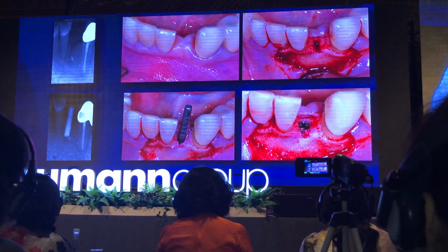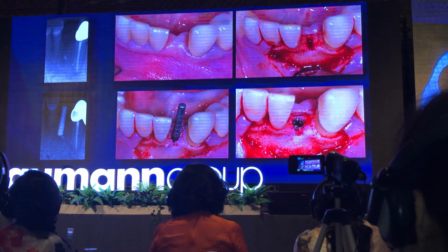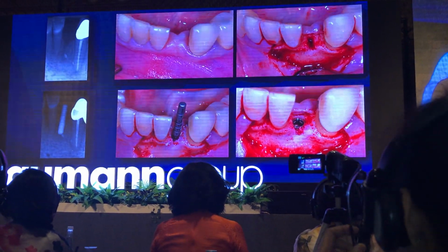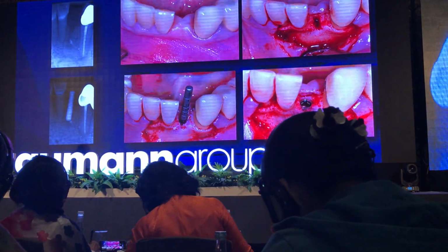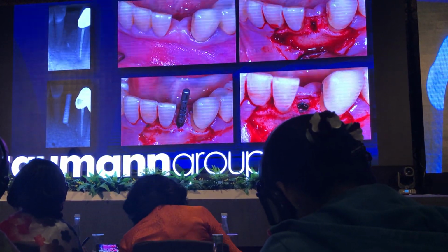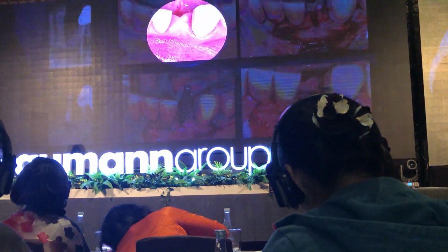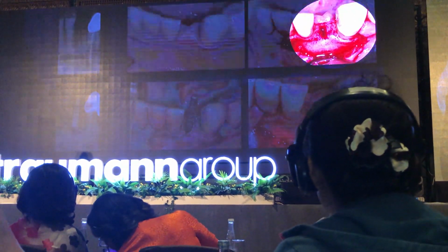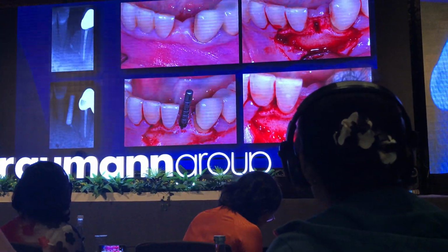So then I like to use a bone level implant, because then the abutment starts from the inner surface of the implant. And we made a decision, we go here with a BLT 2.9. You see the tooth was pulled in a private office, so I got the patient already with the extraction done. See, it's very nicely healed. When we opened up, you see the remnant of the socket. So you see a minor defect on the buccal, it's not much.